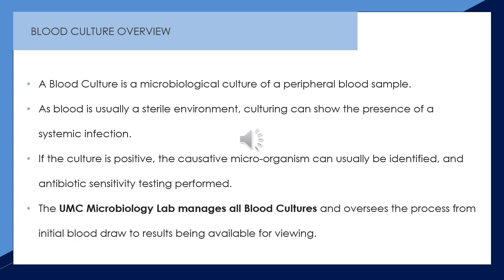Just to provide a quick blood culture overview, a blood culture is a microbiological culture of a peripheral blood sample. As blood is usually a sterile environment, culturing can show the presence of a systemic infection. If the culture is positive, the causative microorganism can usually be identified and antibiotic sensitivity testing performed. The UMC Microbiology Lab manages all blood cultures and oversees the process from initial blood draw to results being available for viewing.